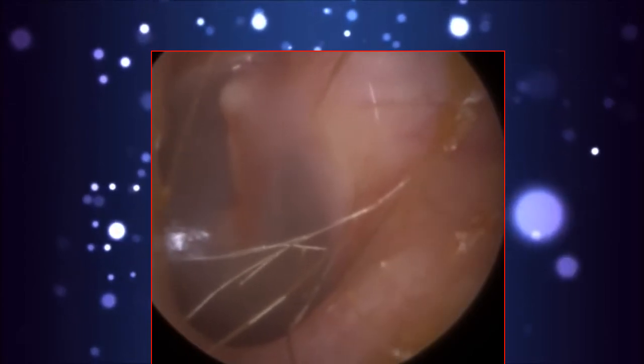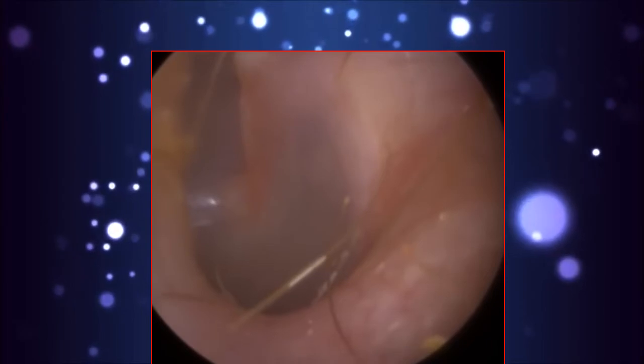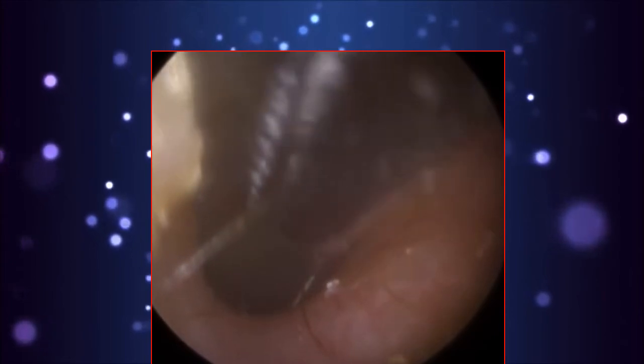So these hairs are just in the isthmus. So there's the forceps, and I know they look large, but in real life they're so small. These 2 hairs I got out without any problem. Suctioning hairs is not always possible, especially when it's stuck here. So this is stuck slightly on the left-hand side of the ear canal. You can see there's a little gap there. And I'm just thinking, can I get in? And I've just grazed it there. Can you see it? You can see the skin that's just grazed. And the patient flinched, and obviously I moved out. So I decided just to leave the rest.